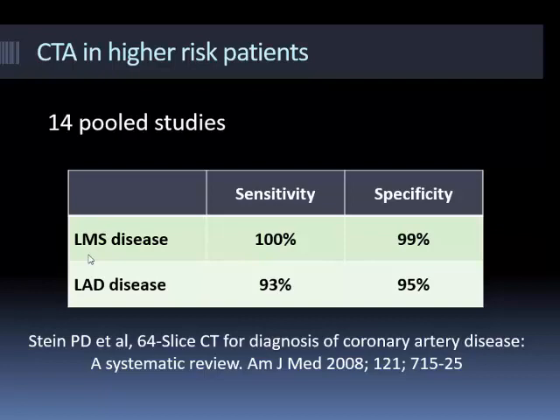I mean, again, for those of you who've not heard about it, you can use computational fluid dynamics, which is basically a way of modelling flow, to predict whether the moderate stenosis, i.e. the 50 to 70% stenosis, are flow limiting. And in terms of correlating it with standard FFR, which is fractional flow reserve, which is a traditional measurement that you use in angiography to assess flow limitation across stenoses, it correlates very, very well. So there's a lot of interest in this technique to help you deal with the moderate stenoses, because it's the moderate stenoses where obviously you can't give that binary yes/no answer.